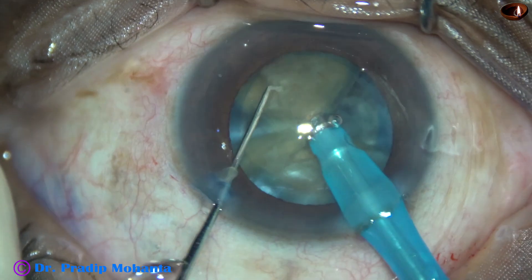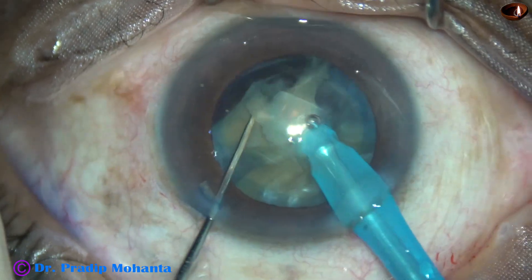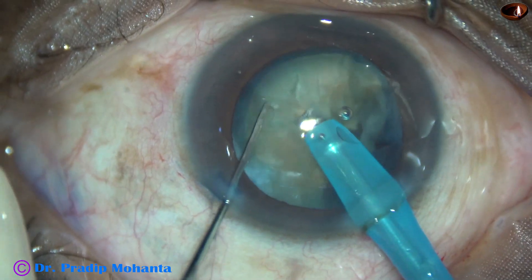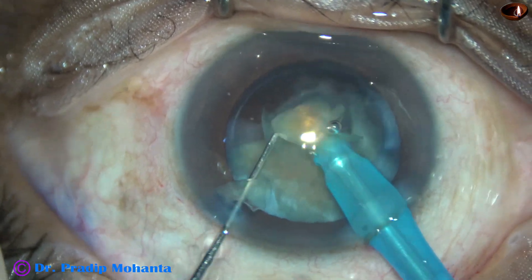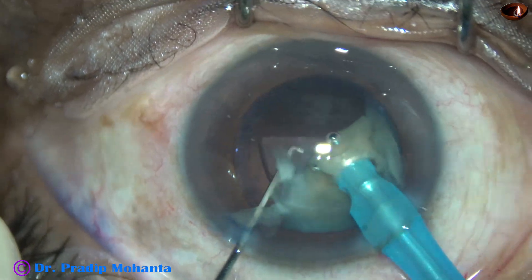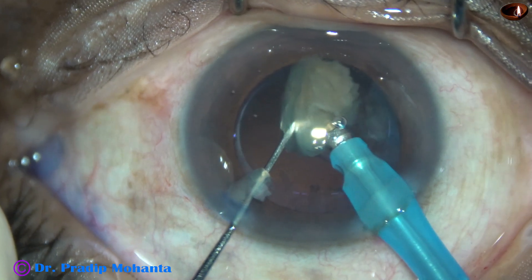The other free fragment is now taken and divided into two small pieces, then emulsified. This is another chop, and the free nuclear fragment is emulsified. Now this is the last portion of the nucleus — it is subdivided into two smaller pieces. This is the last small bit of the nucleus.